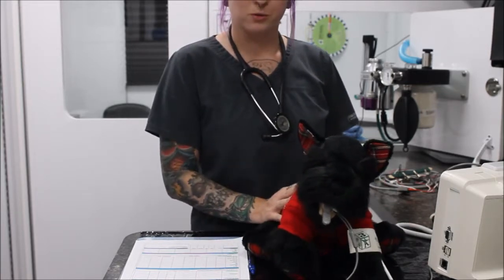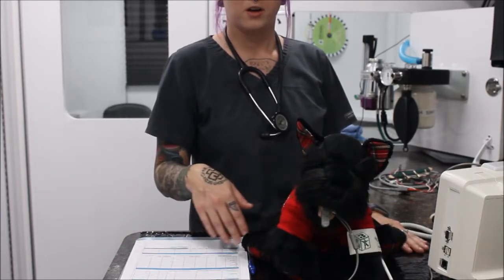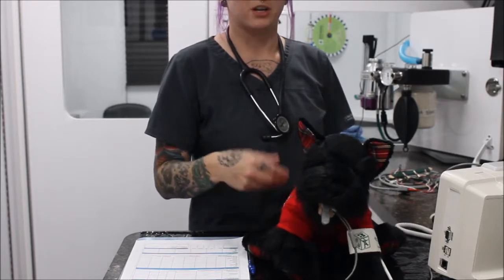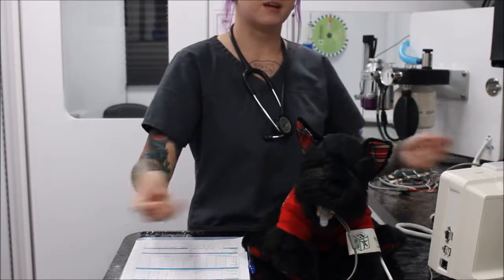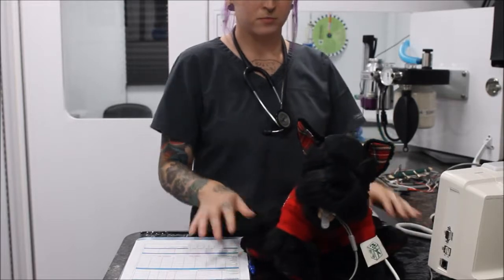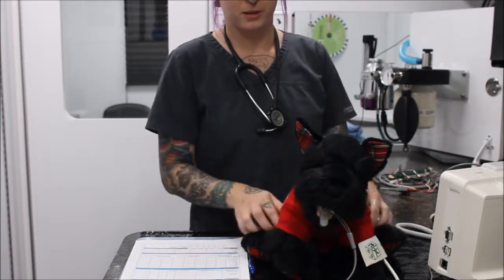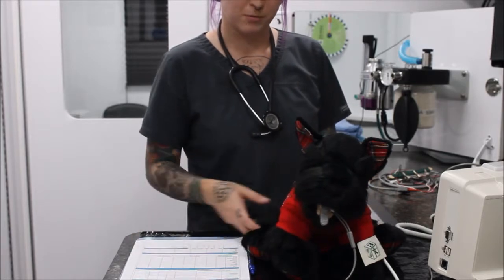And we always use warming devices while our patient is under anesthesia, like a warm water circulating blanket, a Bair Hugger, or a warm towel on top of our patient. And of course, at any point if our patient starts to get too warm, we turn down the blanket or remove it from on top of them. It's really important to monitor body temperature during anesthesia, and after anesthesia. And we always get a temperature before they go under anesthesia, so we have a good idea that they're not running a fever, and what their normal temperature is.